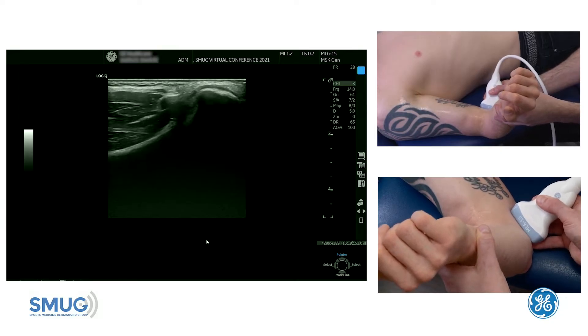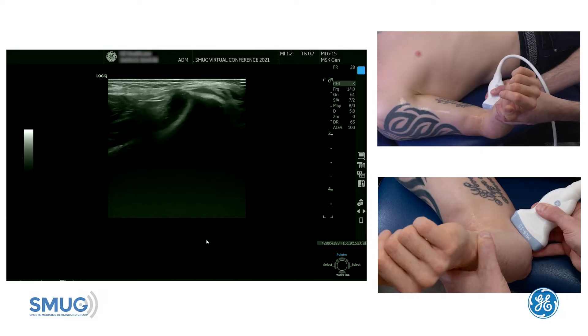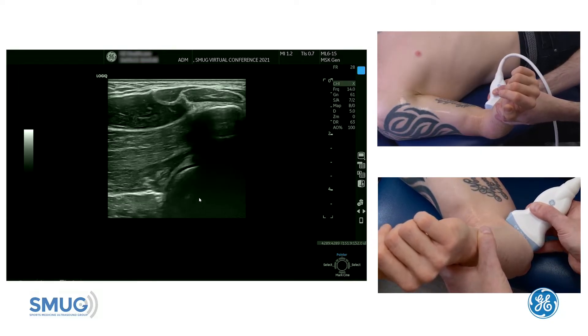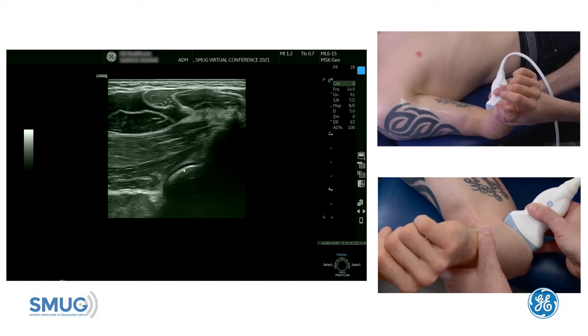I'm going to show you an alternative way of assessing the distal part of the biceps through a medial approach. So we start on the medial side, go forward into the forearm, and the first thing to identify is the radial head with the articular cartilage on top.